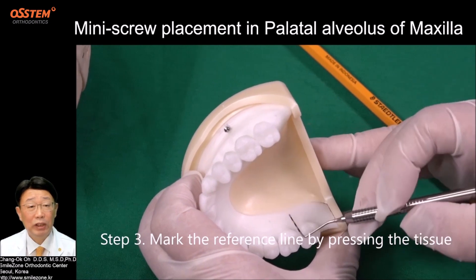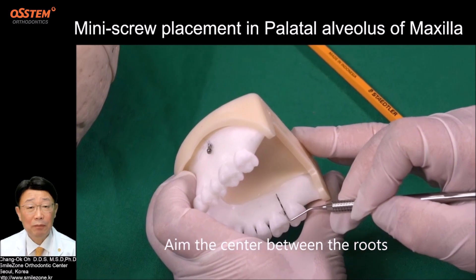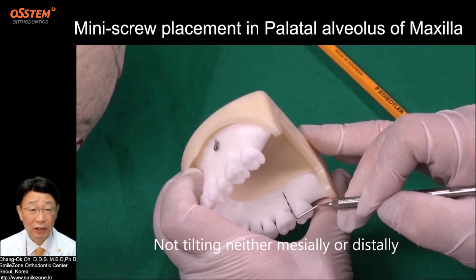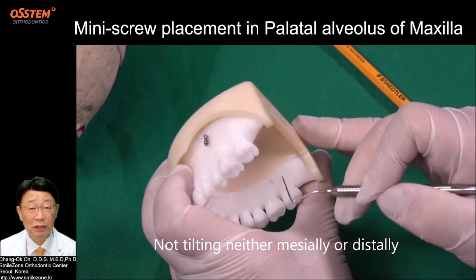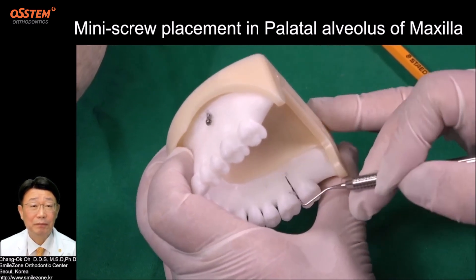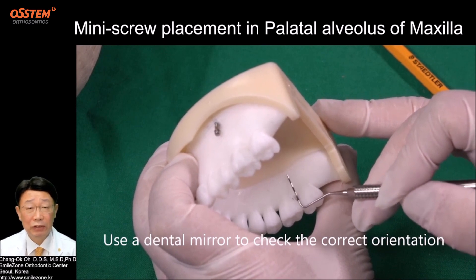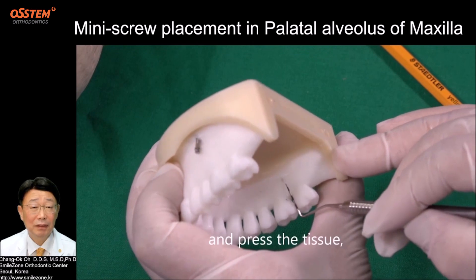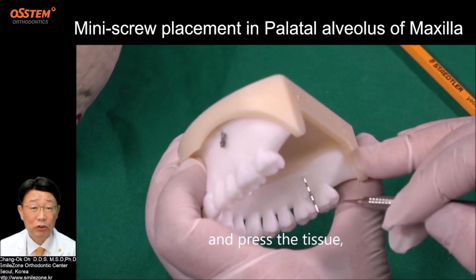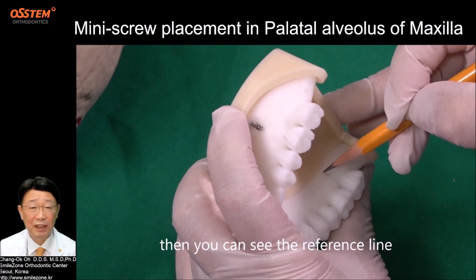Step 3: Mark the reference line by pressing the tissue. Aim the center between the roots, not tilting either medially or distally. Use a dental mirror to check the correct orientation, then press the tissue. You can then see the reference line.